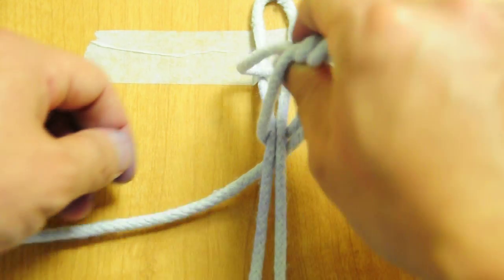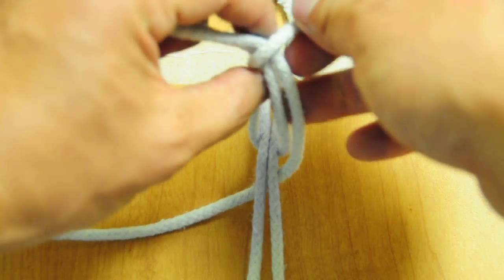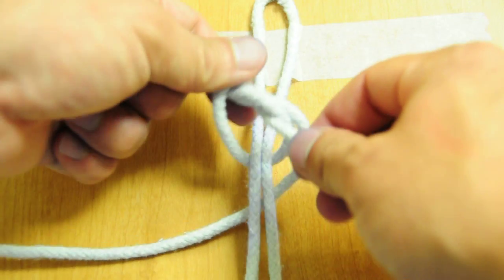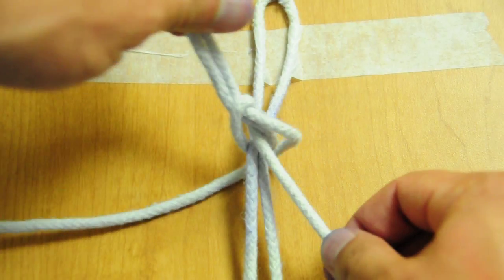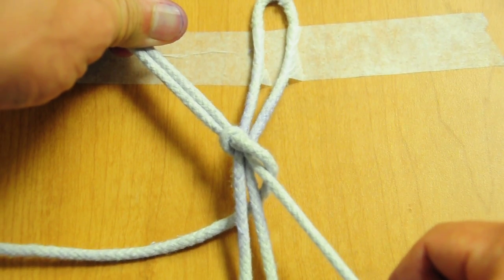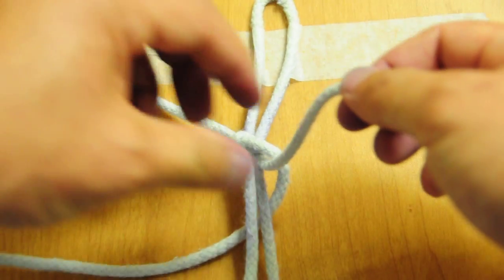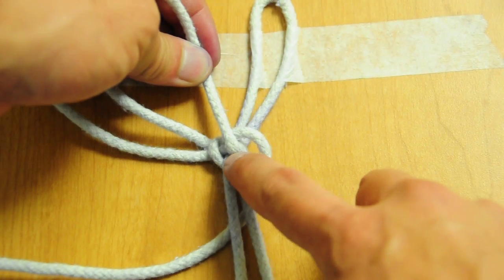See, this would be tying with the loop, and I'll show you the difference. So when you tie with the single strand, like so, cinch down, you have one strand under the knot.